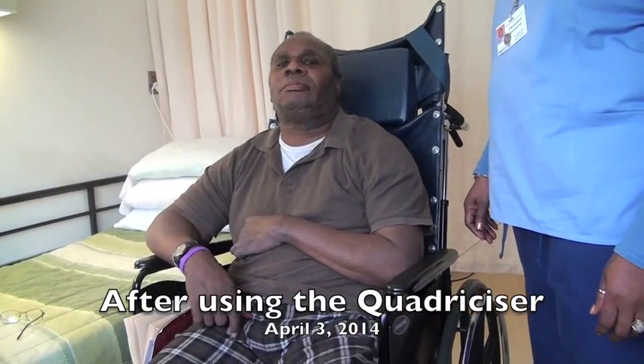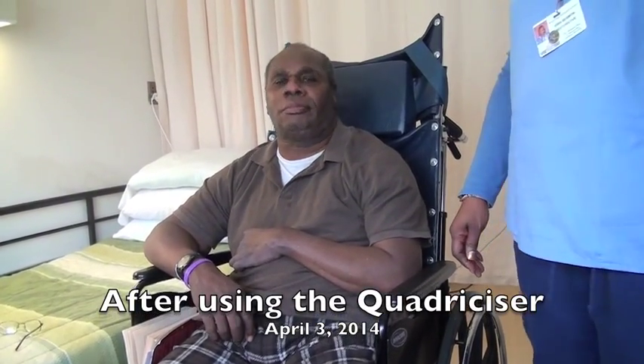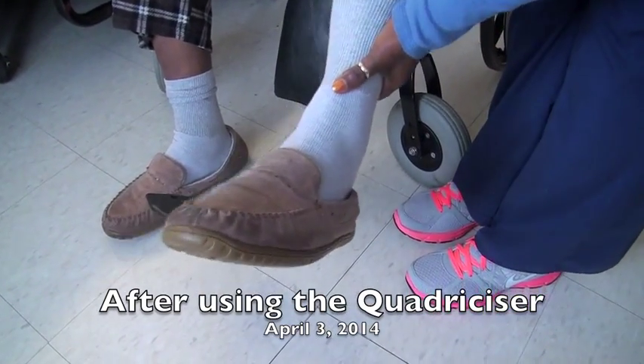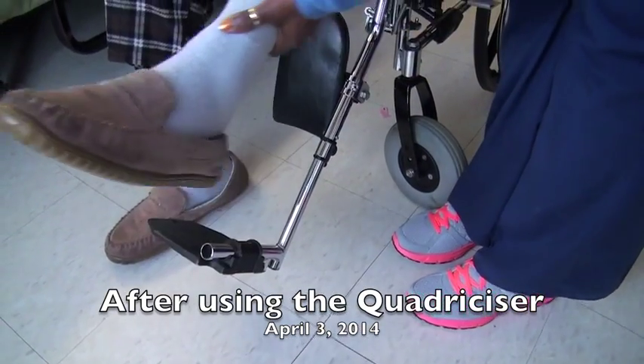How does your leg feel? Great. It still feels good. It did help a lot, still some cause we couldn't raise it up without him complaining.